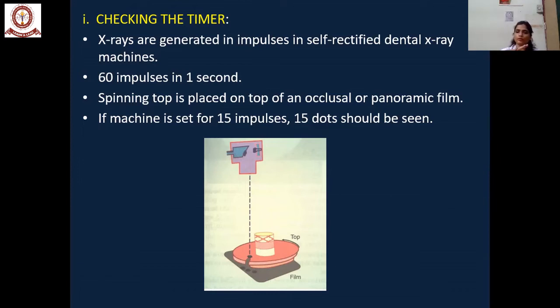You keep the film on the tabletop and rotate the spinning top over the film. You expose the X-ray through the spinning top, which has a hole in the top area. According to the timer, it gives impulses on the film.